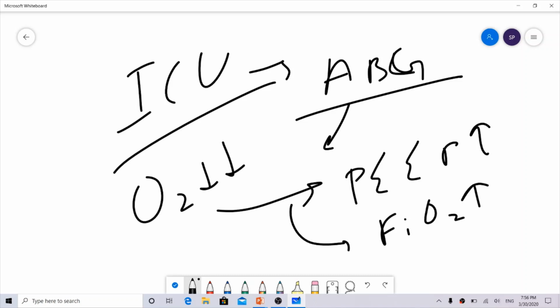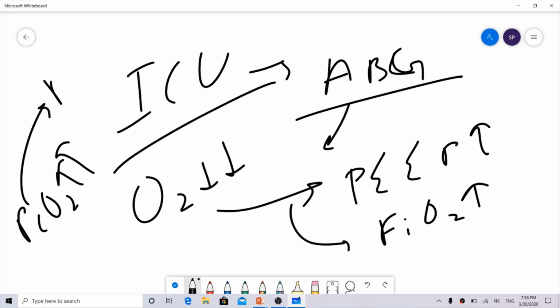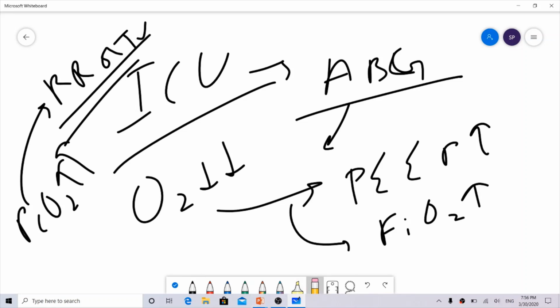Similarly, if the PCO2 is very high, then you may increase the respiratory rate or you can increase the tidal volume. So similarly, these things are very important when you are dealing with these patients in an ICU setting.